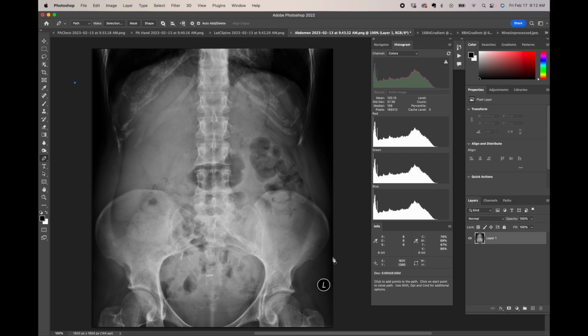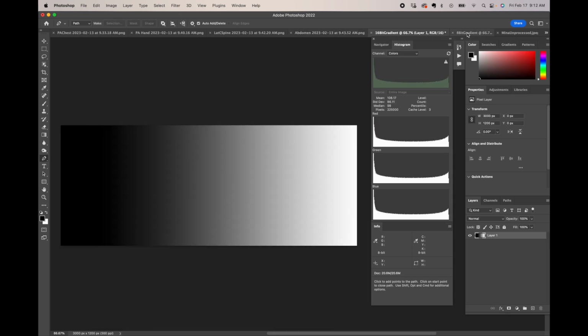So why does this matter when it comes to the images that you're delivering? I'm going to show you in just a minute with these next two images. Right here is a file that I created in 16-bit, and it's a gradient. I just used a gradient tool that would make a gradient from 0, or straight black, to 255, which is straight white. And you see a nice smooth transition from straight black to absolute white here.